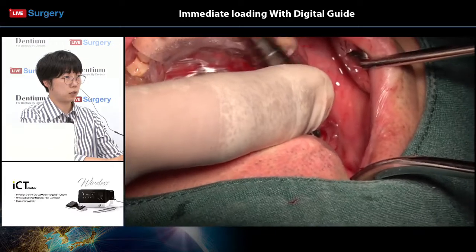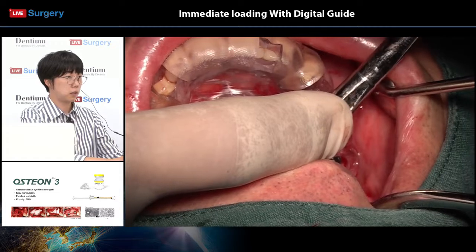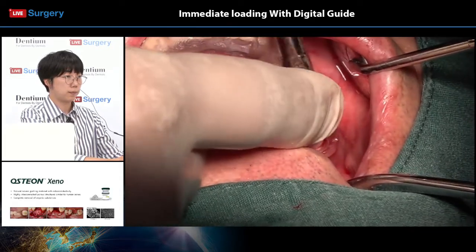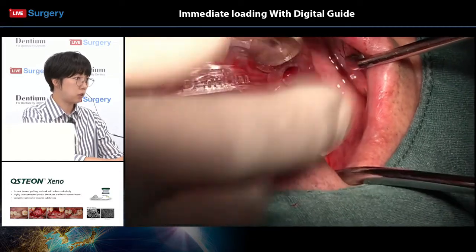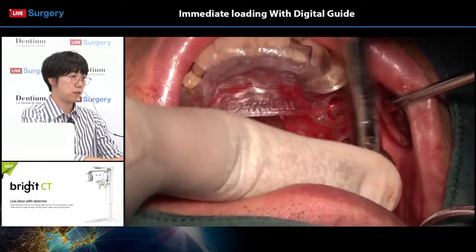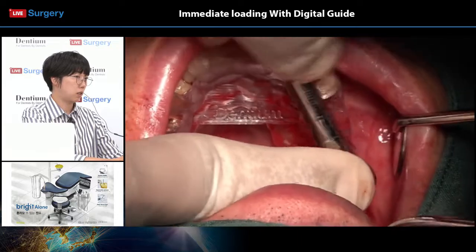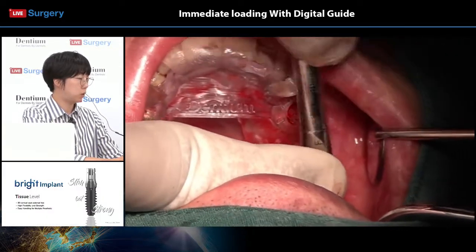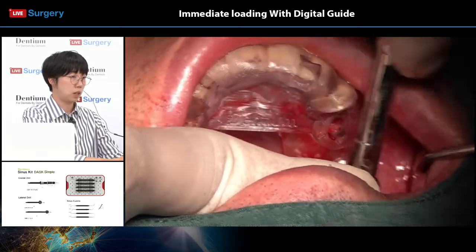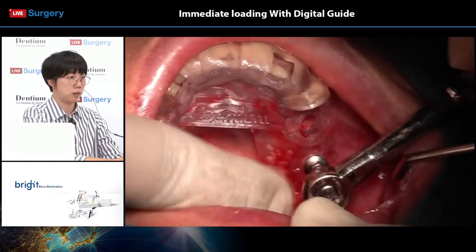Okay, he's finishing the implant positioning using a hand ratchet. Dr. Lee has just mentioned that the initial stability on the upper left side is a little unsure. So I believe he will be finishing the surgery on the upper left side by only connecting the healing abutments and not performing immediate loading on this area.